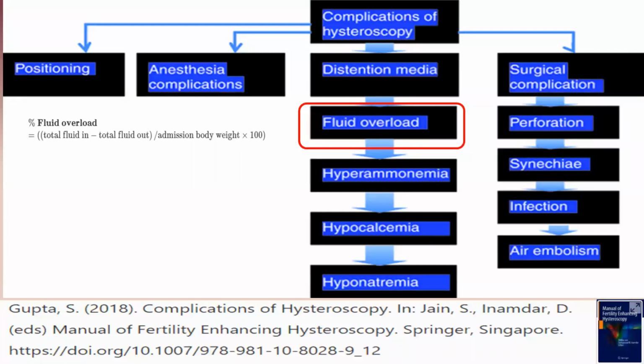We know that hysteroscopic complications are too many, including some technical problems, some anesthesia problems, and one of the complications of hysteroscopy actually is distension media complications, particularly fluid overload and its sequelae.